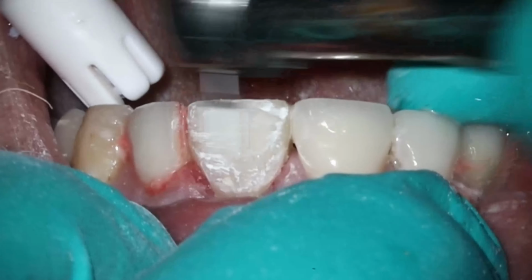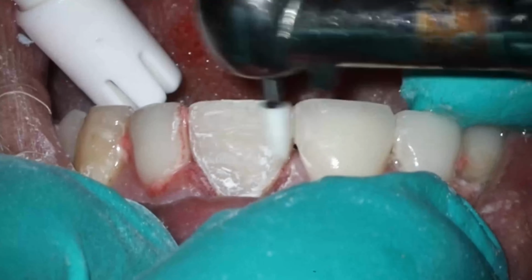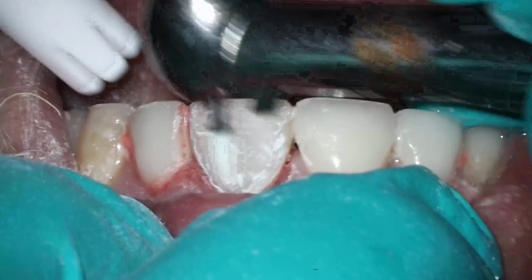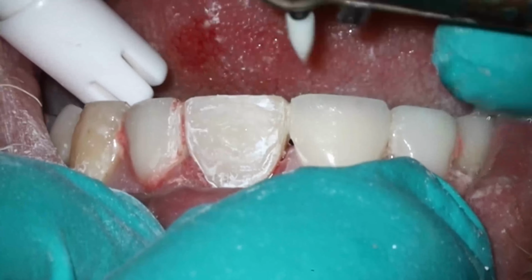Like I said, I'm not going to go through the full Rockstar polish because it only has to last a week. So a quick hit with a white stone just to get it a little bit shiny and smooth off some of those imperfections. And you'll see here in a minute, I'm really pleased with how this looks.